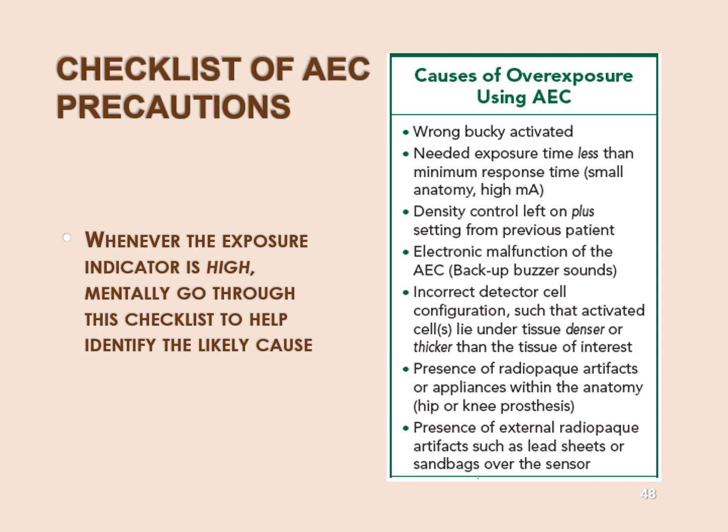Needed exposure time is less than the minimum response time. This is typically your pediatric chest. Don't use AECs for pediatrics.